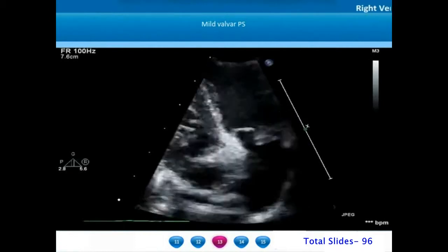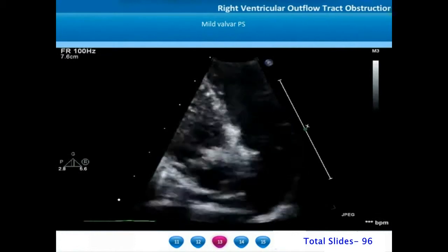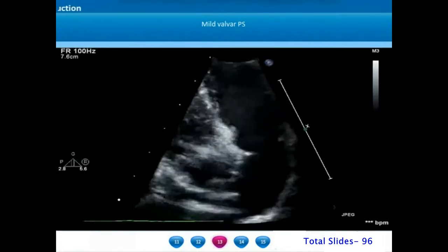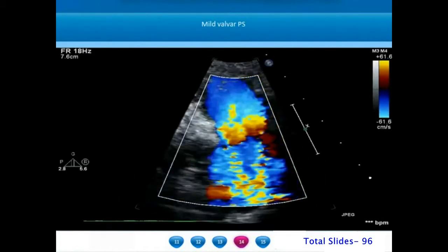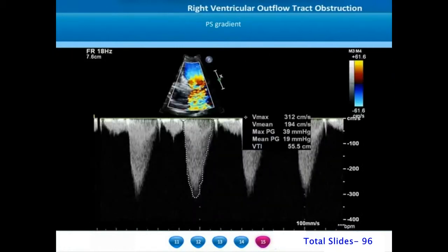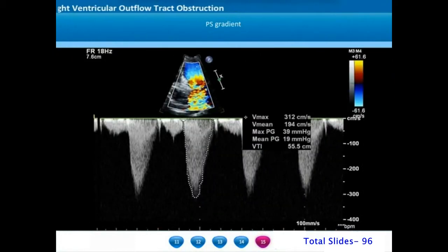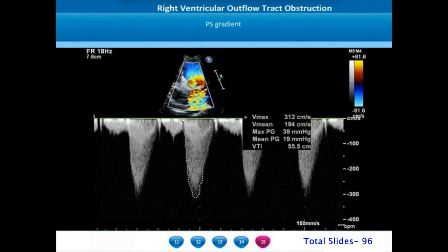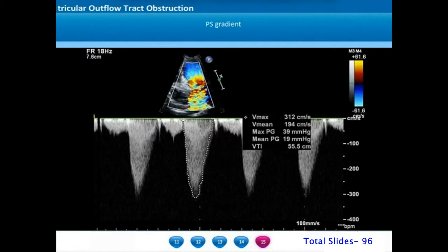In this next example, there is doming indicating valvar pulmonary stenosis; however the orifice seems larger with mild pulmonary stenosis, confirmed by color Doppler. On continuous wave Doppler, the mean gradient is 19 mm of mercury and peak gradient is 39 mm of mercury. A gradient less than 25 mm of mercury is classified as mild, 25 to 50 mm of mercury as moderate, and exceeding 50 mm of mercury as severe pulmonary stenosis.